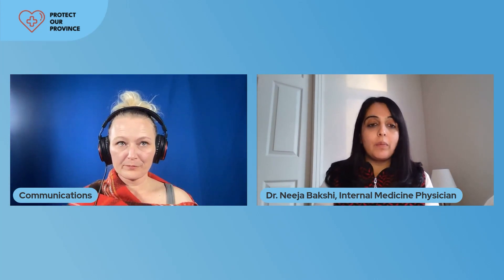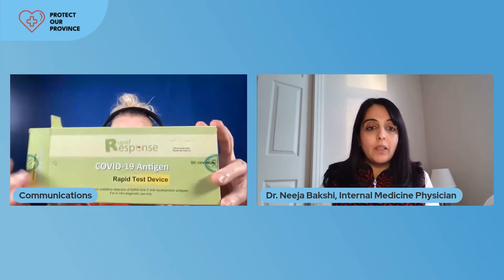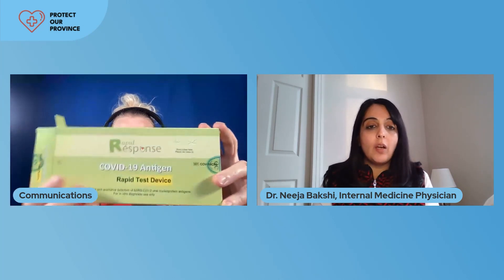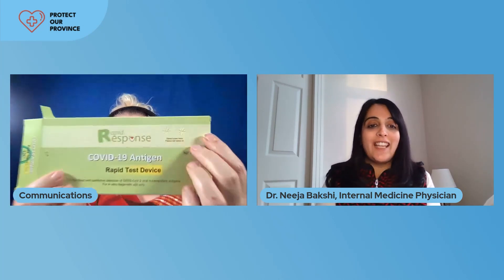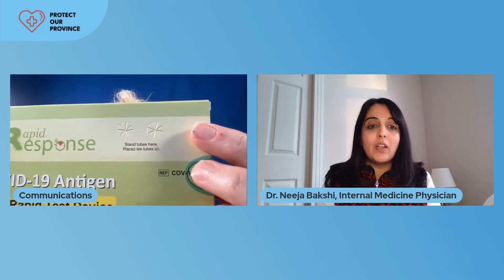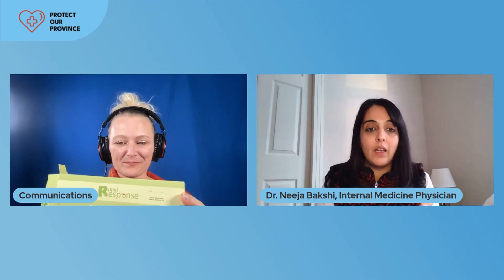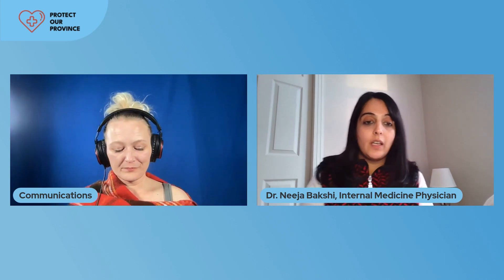First things first — hold up the box. An important piece of this box is some perforation that you'll see on the top right-hand side. Those are important. That's going to be the place that can hold the tube that you're using for testing. Make sure that you don't just rip this box open and that you have that area available to you as you do the testing.